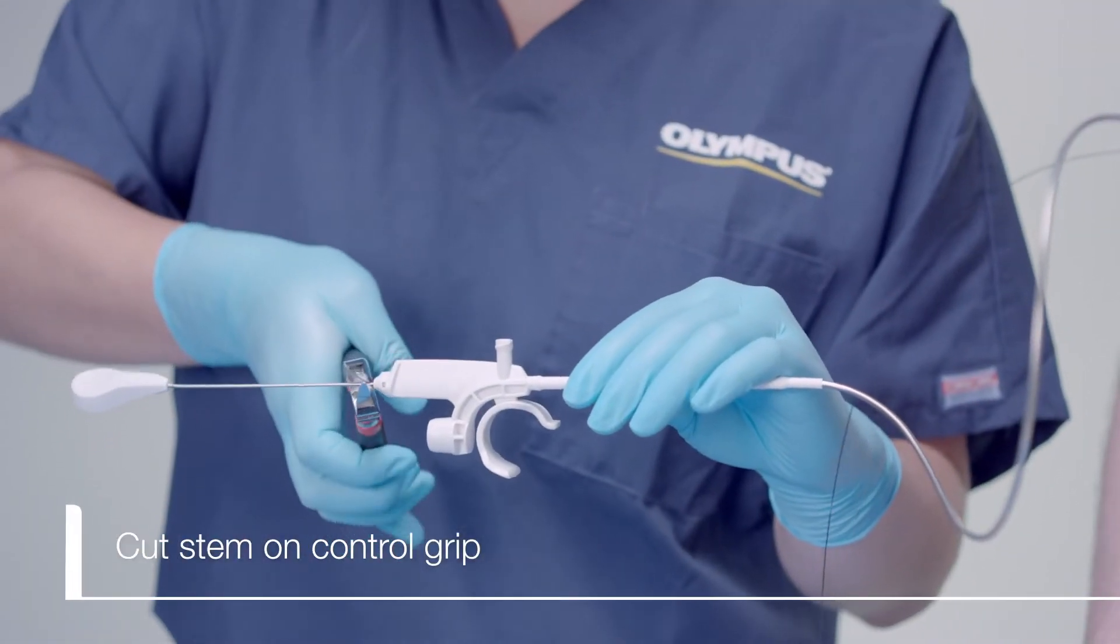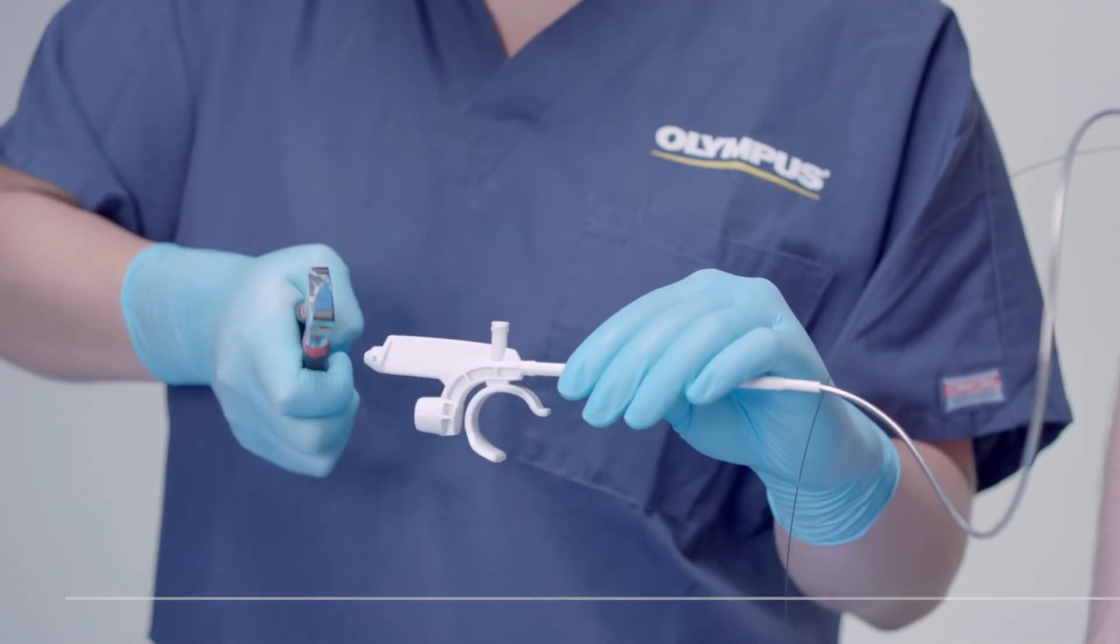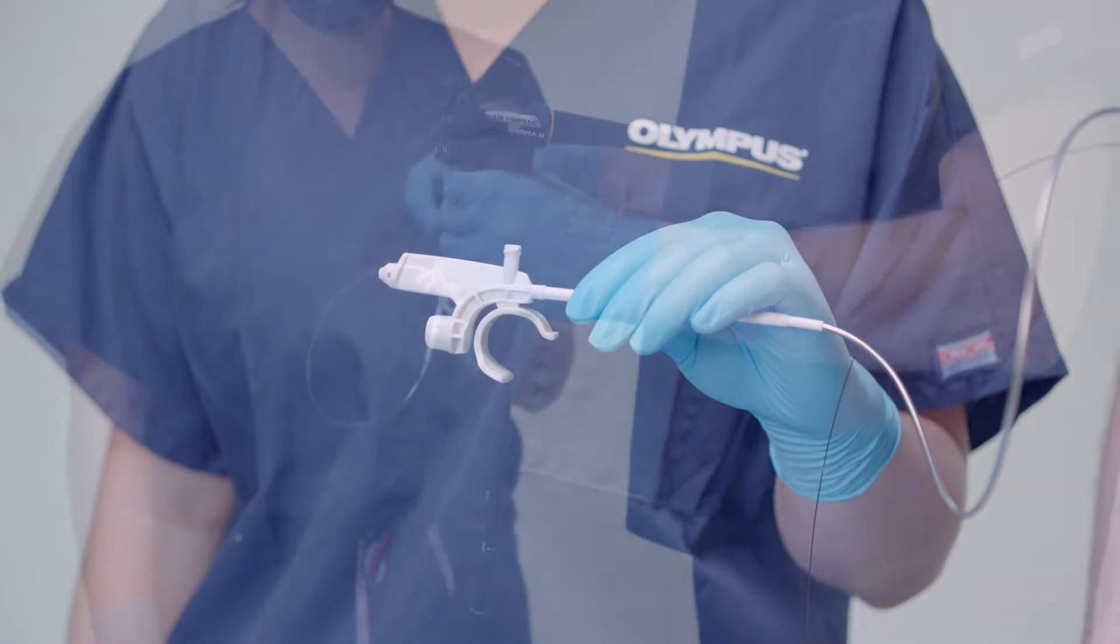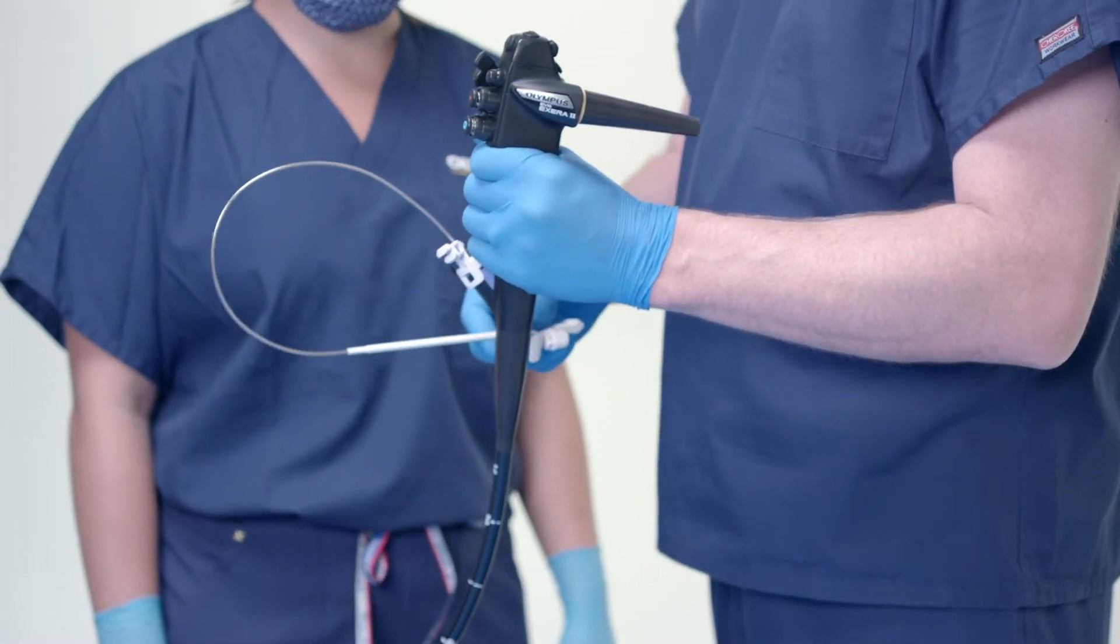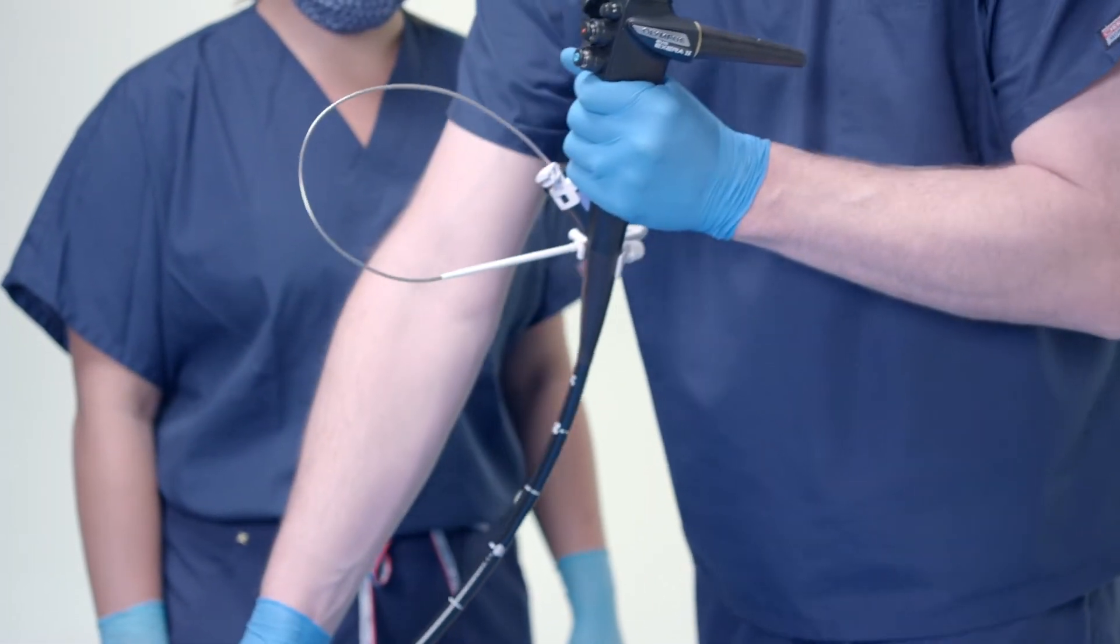First, cut the stem on the VortiCatch V Control Grip. Wire cutters are not provided by Olympus. If the guide wire is still in the patient, then remove it at this time.